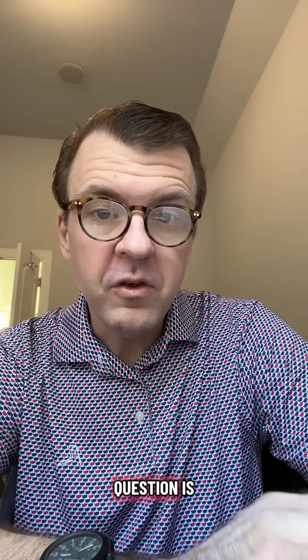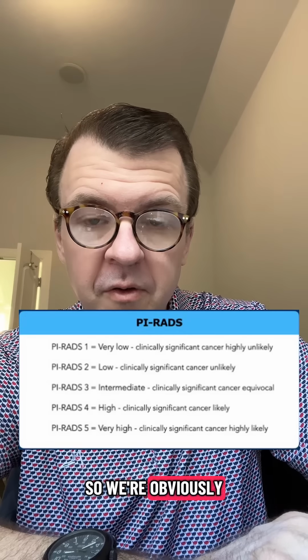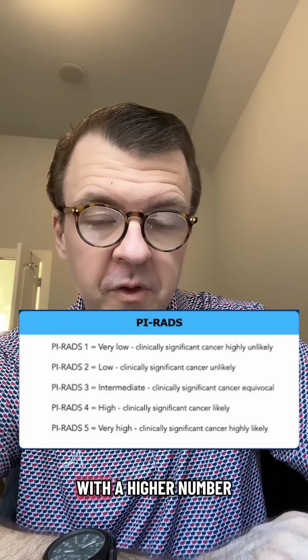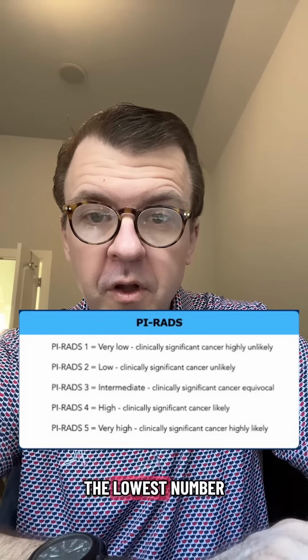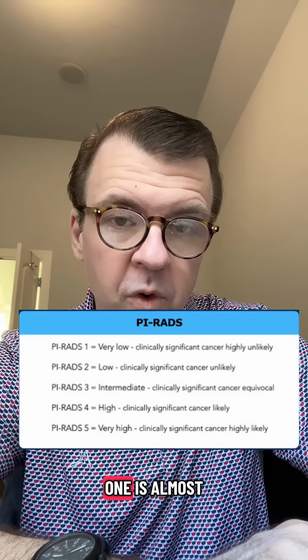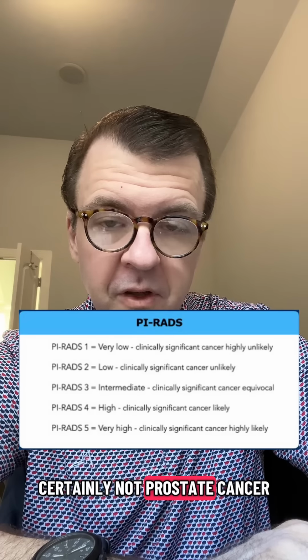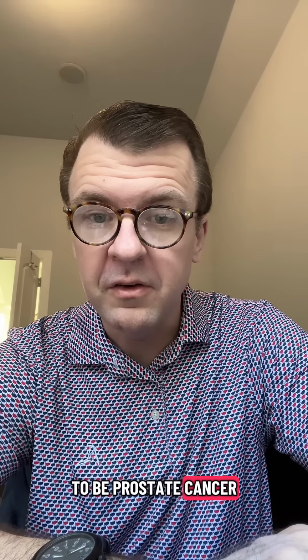The second question is, what is the PIRAD score for any lesion? Sometimes there's more than one, so we're obviously going to be concerned with the lesions with a higher number or higher risk for prostate cancer. The lowest number you can get is a 1. The highest number you can get is a 5. A 1 is almost certainly not prostate cancer. A 5 is almost certainly going to be prostate cancer.